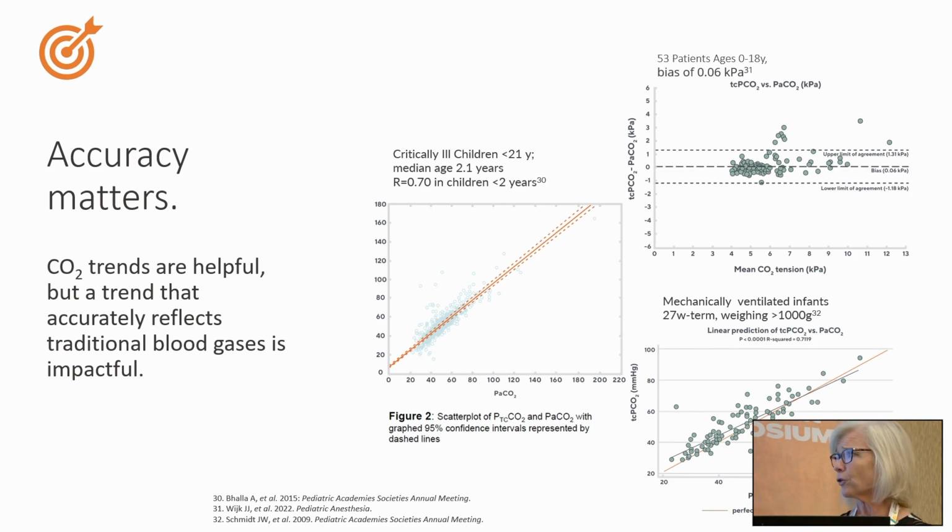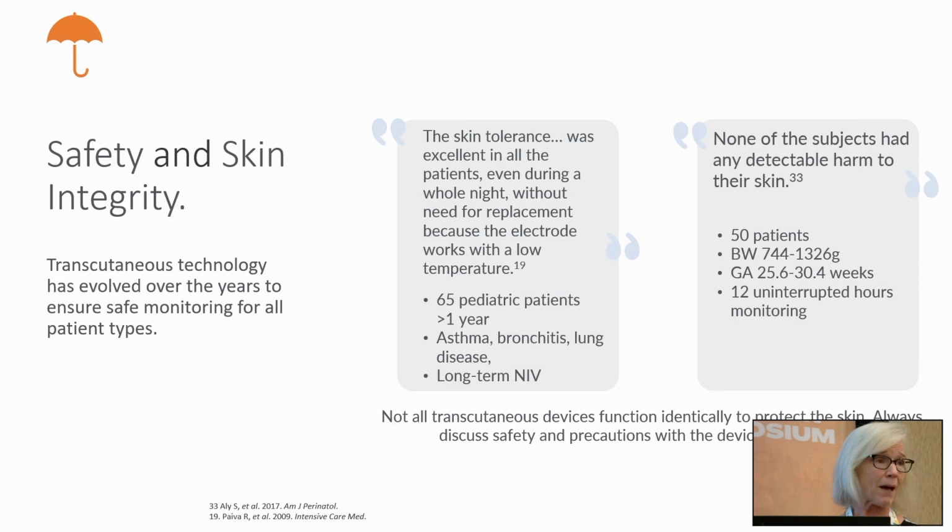If you have used this technology in the past, like let's say 15 years ago, the thing that you might remember is that the heat from the sensor would cause some redness on the patient's skin and would have to be moved very frequently. Because now digital technology is using lower sensor temperatures, we don't see that. What that means is that you can leave it in that same spot for 8, sometimes even 12 hours, monitoring continuously for 8 to 12 hours without needing to change a spot.